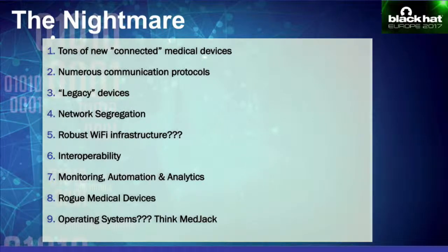And if you combine that with portable medical devices that patients will start to bring with them. For example, if I am diabetic, I could buy an insulin pump and then take that to my medical institution and tell them to associate it with the hospital network. So hospitals will have to make sure that they have enough bandwidth to support all these devices so that their wireless or wired infrastructure does not choke when all these devices connect.